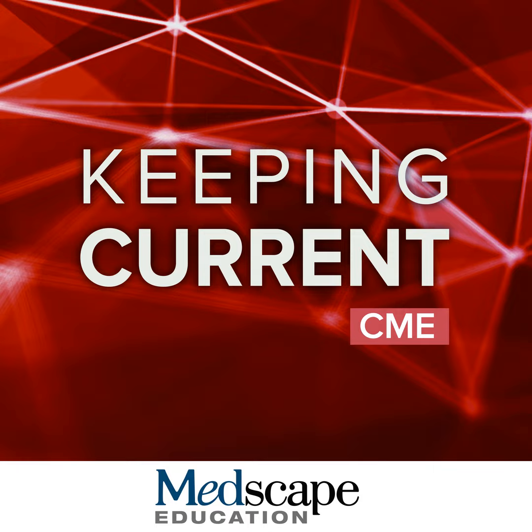And if we look at hepatobiliary phase as a feature, it is an independent predictor of early HCC, even after we account for arterial phase hyperenhancement, diffusion restriction, and lesion size. So it's a very important feature.